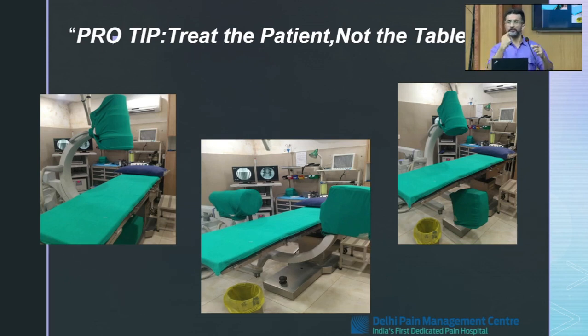So what is the direction of the foramen? The patient is lying supine. The patient's foramen ovale is here. So the patient's head is here, leg is there. So what we will be doing is putting the C-arm in position like this. It has to be aligned. So one is AP, another is oblique.